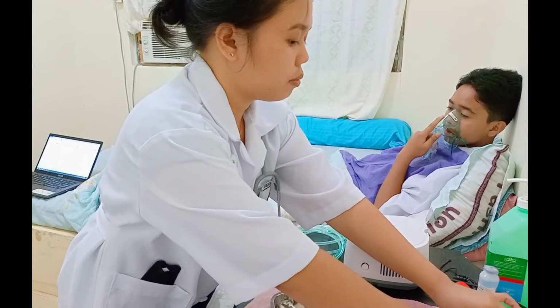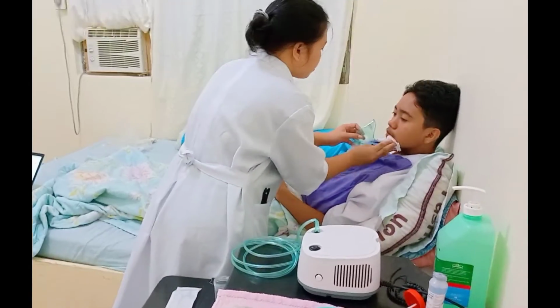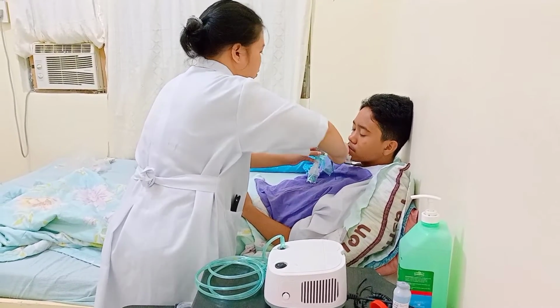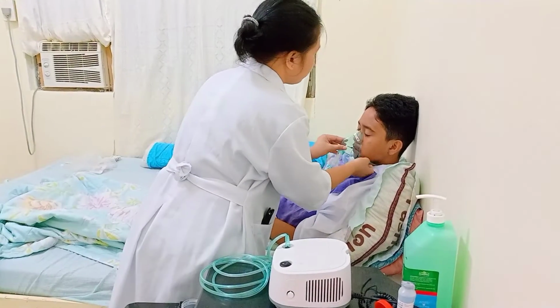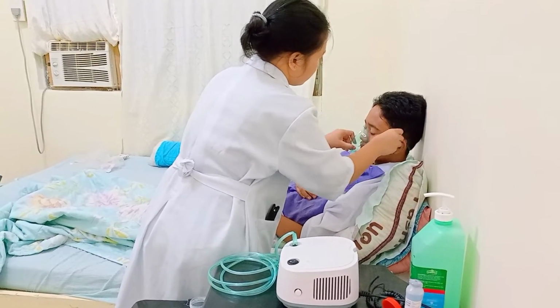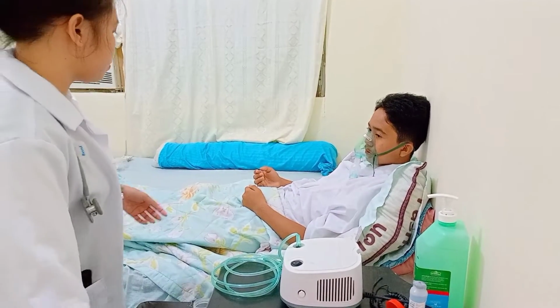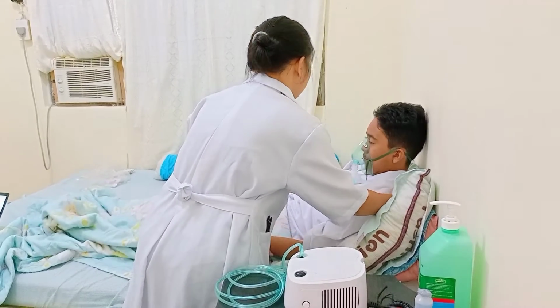Next is to promote client comfort. Assist the client to a position that facilitates breathing. For the comfort of my patient, I wipe the face, nose, and mouth. Assist the client to a position that facilitates breathing. This promotes the patient's comfort.